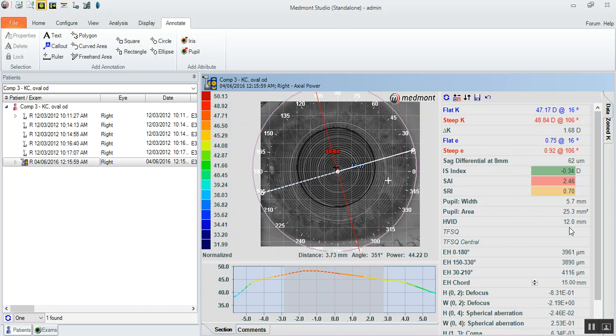In other words, in order to have room to clear the limbus and protect the limbal stem cells, the diameter of the scleral lens needs to be at least a certain distance away from that particular measured visible iris. So visible iris plus 3.5 millimeters gives you a ballpark of where you may want to be in initial lens diameter.